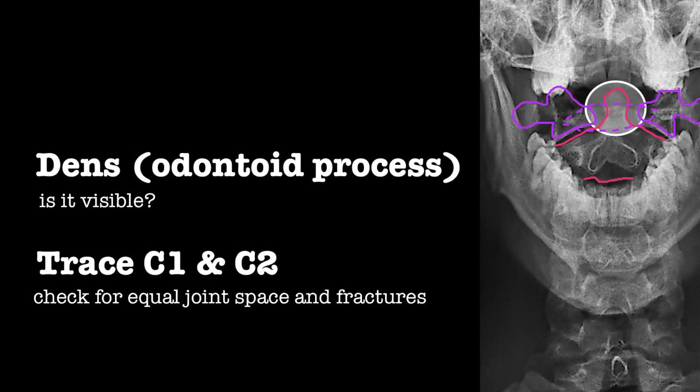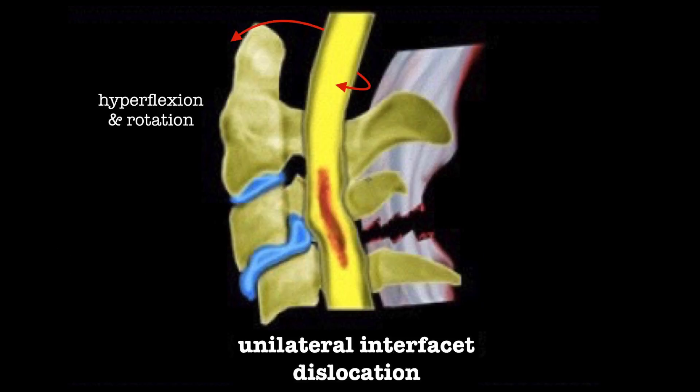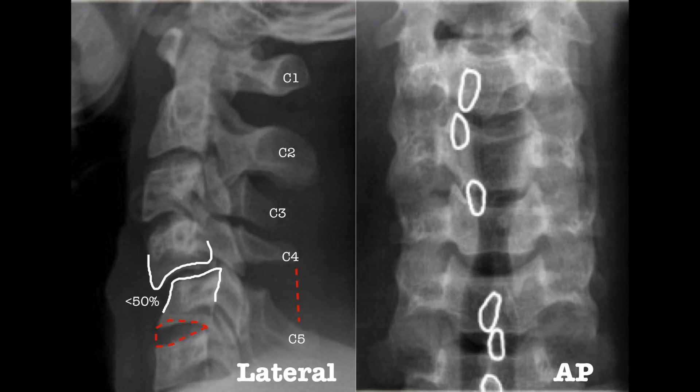Now we'll briefly discuss interfacet dislocation. Unilateral interfacet dislocation is due to hyperflexion and rotation, causing the inferior facet on one side to slide over the superior facet and become locked, causing anterior subluxation of the vertebral body of less than 50%.